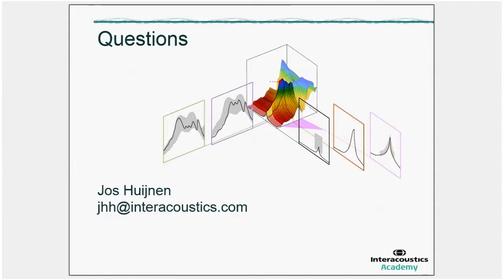It is absolutely in our benefit to combine research, particularly on pathologies where it is difficult to collect bigger amounts of data. The problem we had during the development is that we wanted to make learning to interpret absorbance measurements easy, and for the different pathologies, we think it requires showing a normative area that fits a specific pathology. But we were not allowed to implement it because the data sets that would be the base of these normative areas were simply too small. And what we see is that the individual research groups either need a lot of time to get a sufficiently big population with these special pathologies, or we need to combine them in order to get an appropriate data set to be used as a norm data set for a pathology. So we really like the idea.